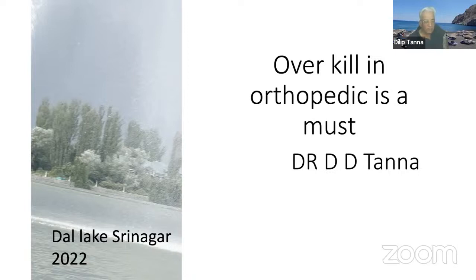But if it is an atypical fracture where the medullary cavity is blocked, which you can see in a good CR, in that situation you will have to ream right up to the level to which you want to pass the nail. Or in an occasionally very thin medullary cavity, you will have to ream, because even a 9 number nail you may not be able to pass at times. Otherwise, in the majority of the elderly, when you do the short PFN, you don't have to ream anything more than the proximal part.